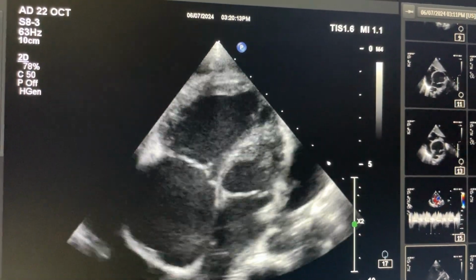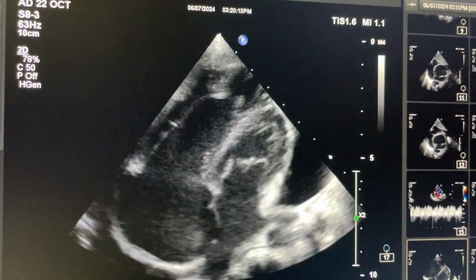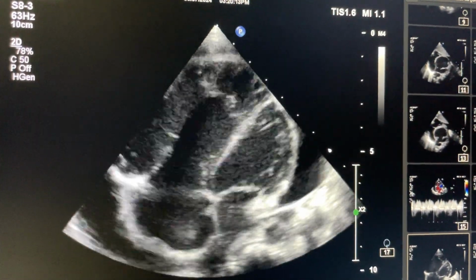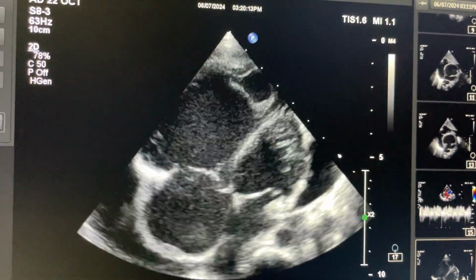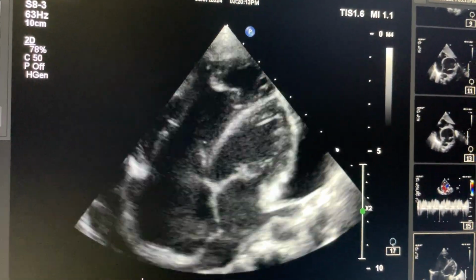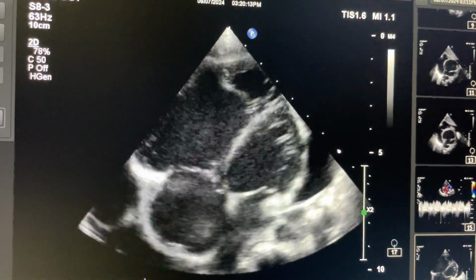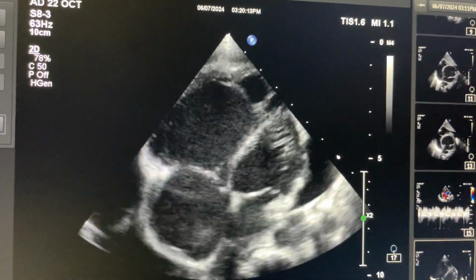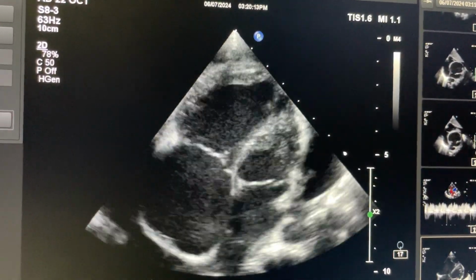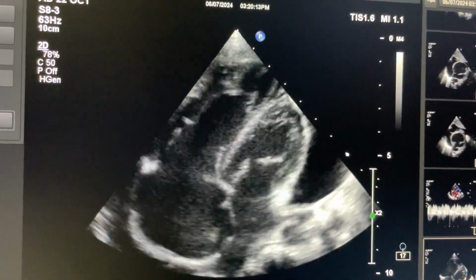So in this case, right atrium and right ventricle are severely dilated because of ASD. Though this child does not have clinical features of tamponade, echocardiographically you also don't find any right atrium or right ventricle collapse. So no evidence of tamponade. The only thing I want to say in this video is that whenever there are causes of high right atrium and right ventricle pressure from some other pathology, early tamponade will be missed.